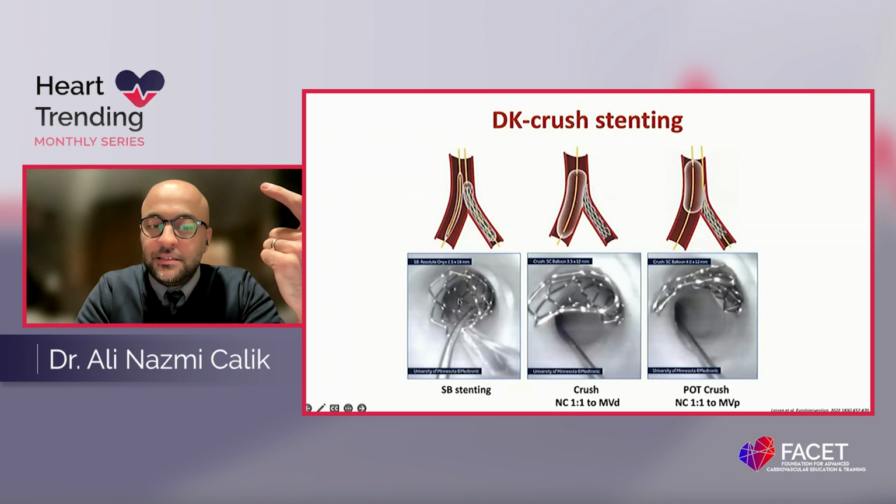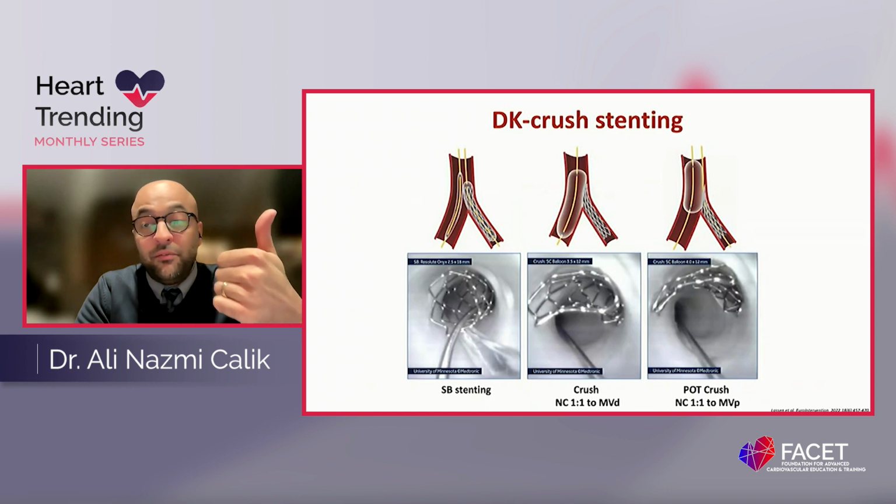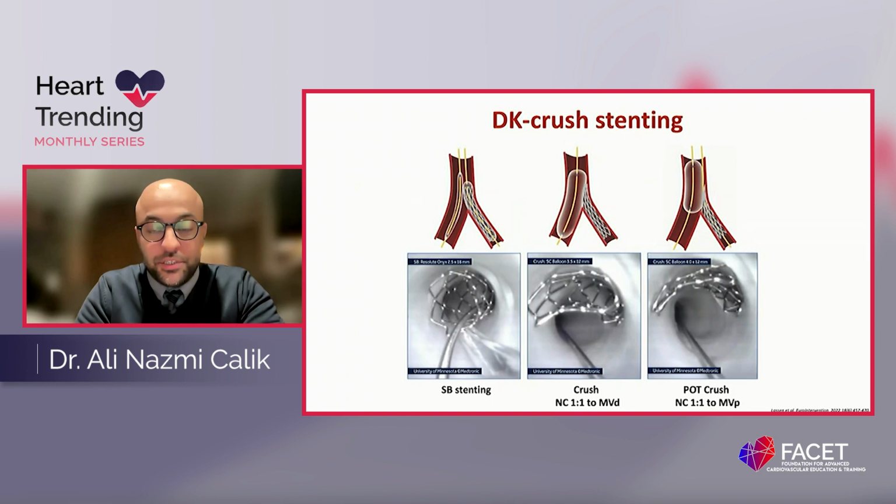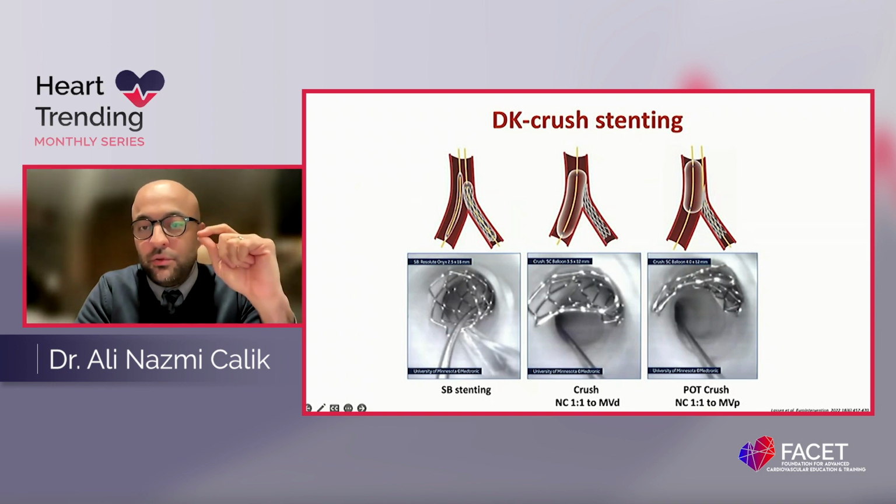After you stent your side branch and pull it to the main vessel, of course, because we are going to crush it, if you do the crush with a balloon sized to the main vessel distal, this is what you get: an incomplete and inadequate crush. Probably that will lead you to rewiring issues or issues advancing the gear in your next steps. So now we always have to integrate this second crush, which is called POT crush.